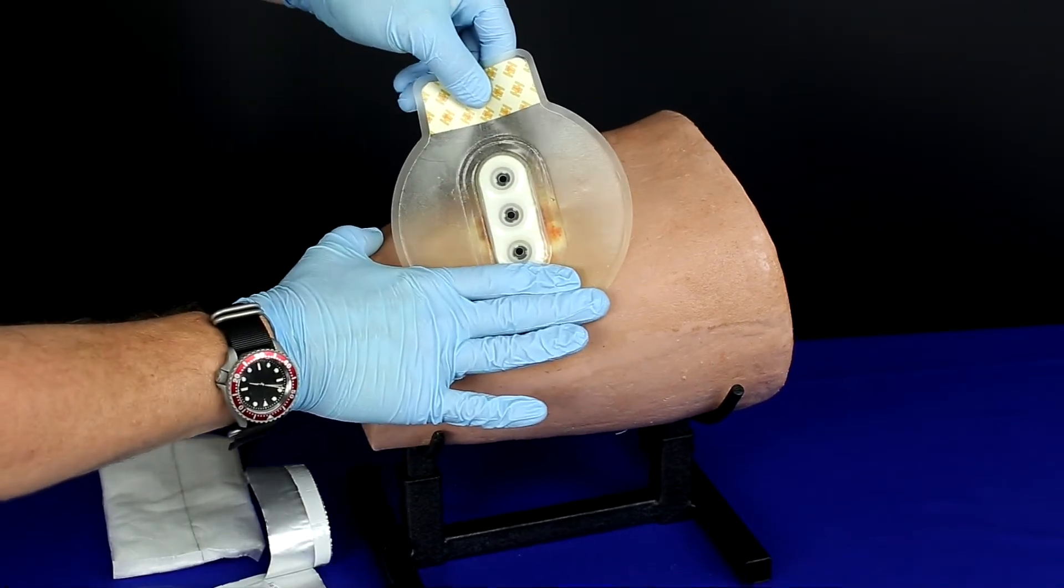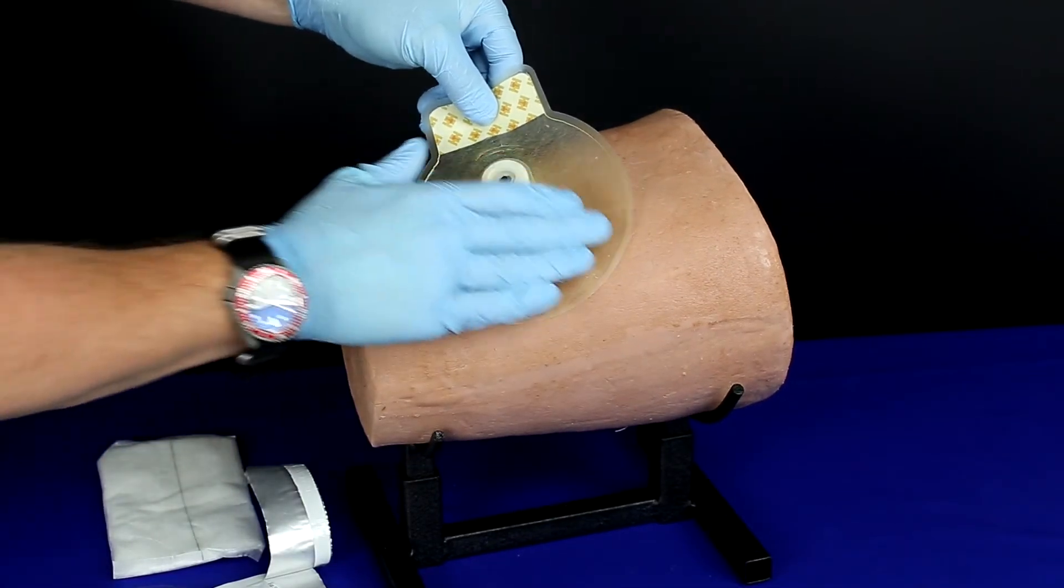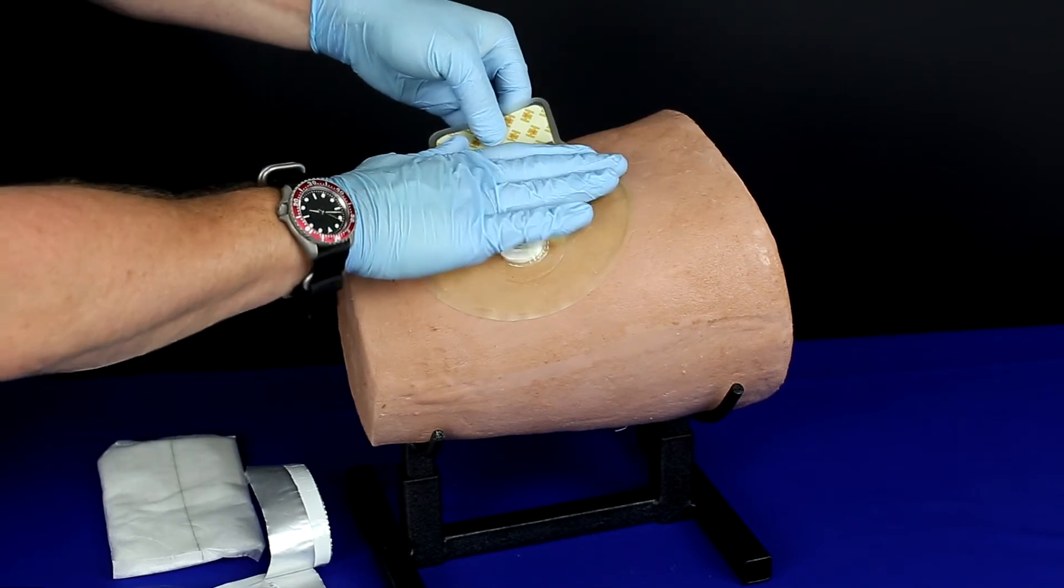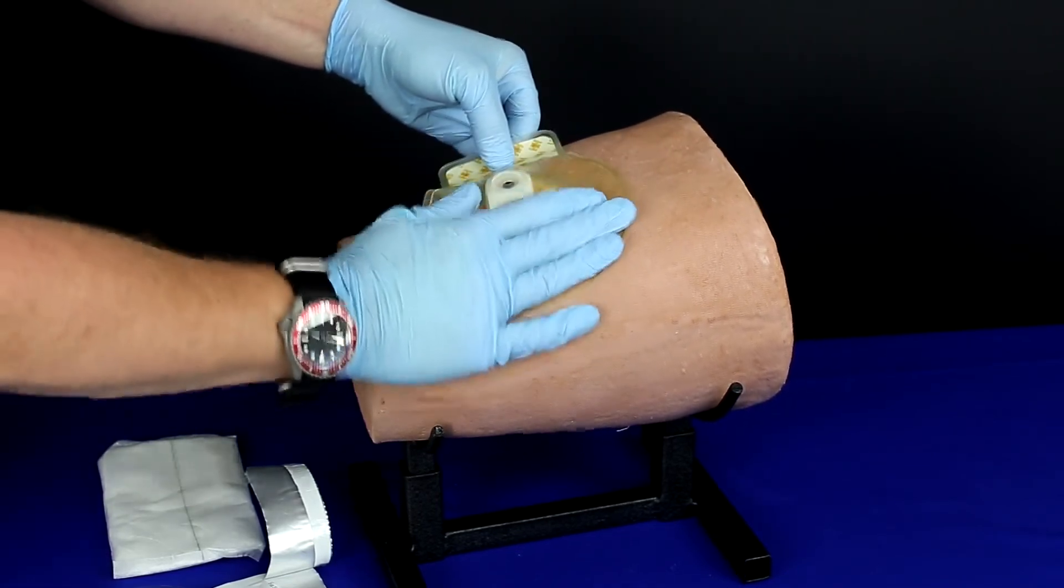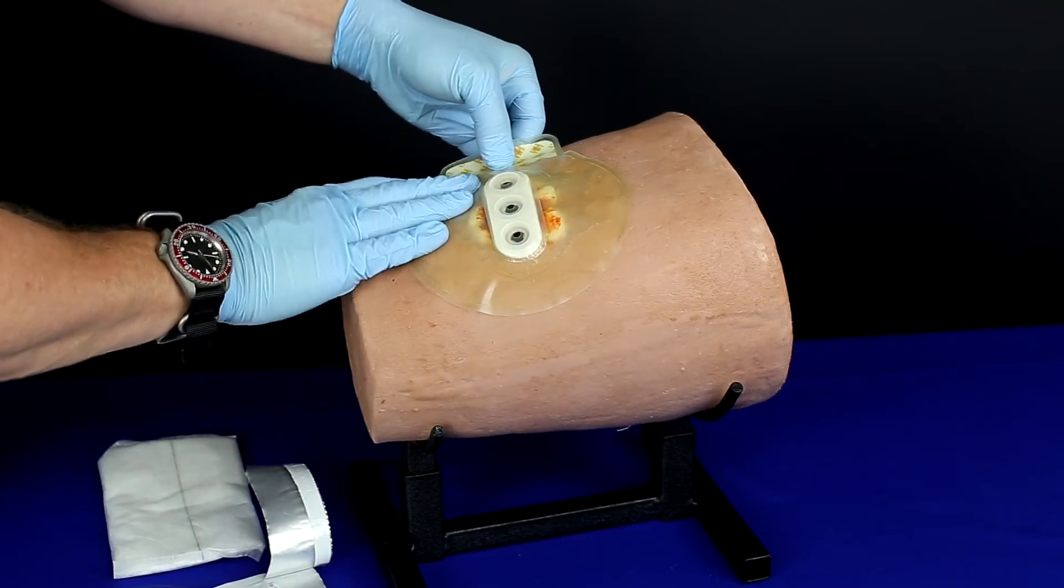Starting on one side of the wound, place the BCS against the skin and press firmly. Apply pressure as the seal comes into contact with the skin to ensure full adhesion. Place the valves directly over the wound site.